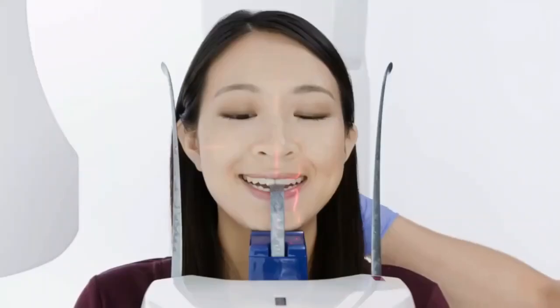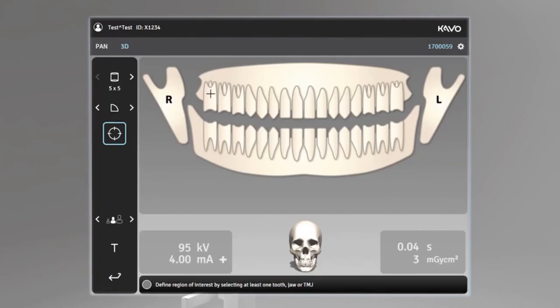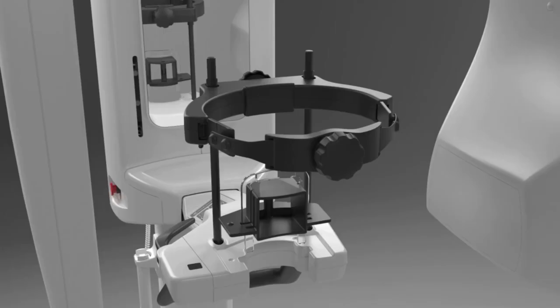The arm moves and its trajectory may be described as a rotation around an instant center which shifts on a dedicated trajectory. The manufacturers propose different solutions for moving the arm, trying to maintain a constant distance between the teeth to the film and generator.